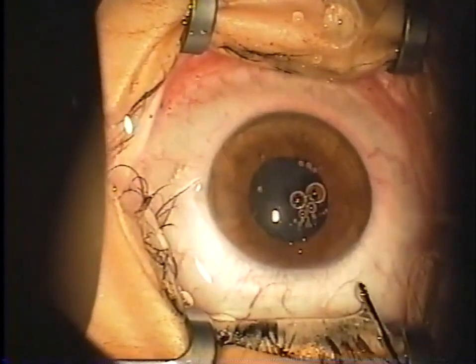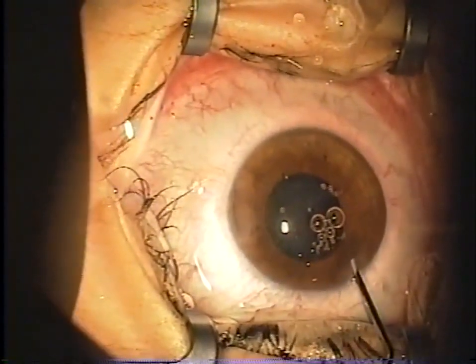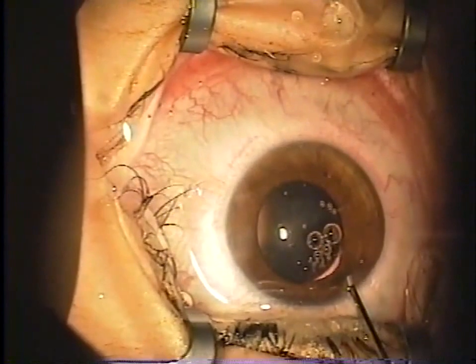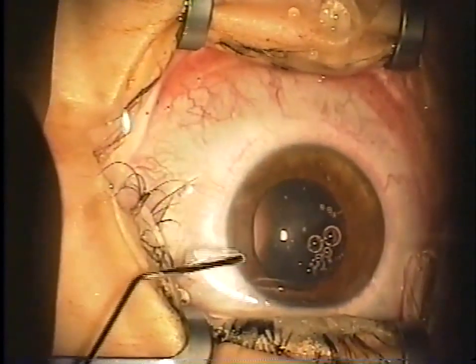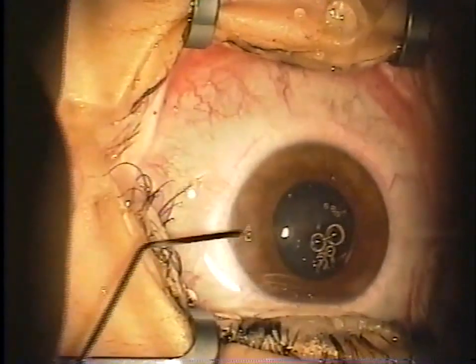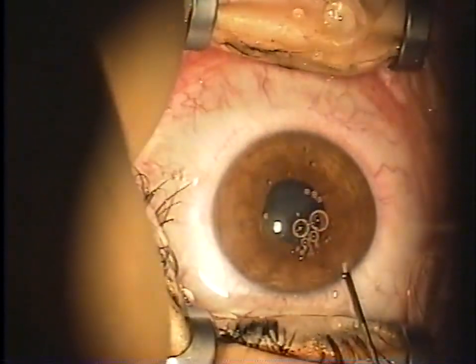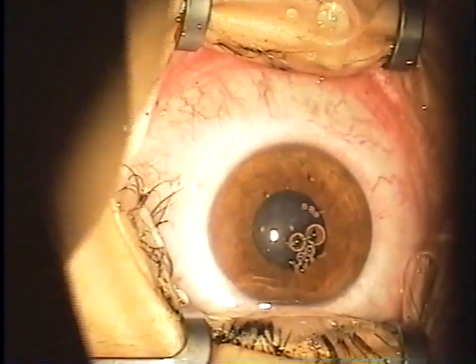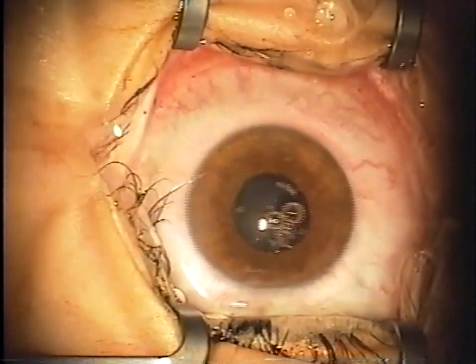You can see here that there is no PI. Visian ICL company recommends that a PI is done a few weeks prior to the procedure. We found that to be uncomfortable for the patient, and as a result we do a PI with a YAG immediately following the procedure while the patient is still numb. The patients are then checked 2 to 4 hours later, the following day and 1 week later, to assure that the ICL is lined up and that the PI is patent.